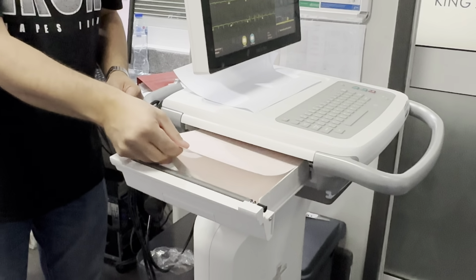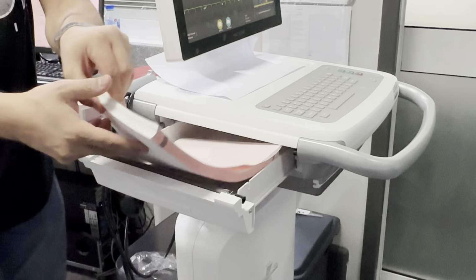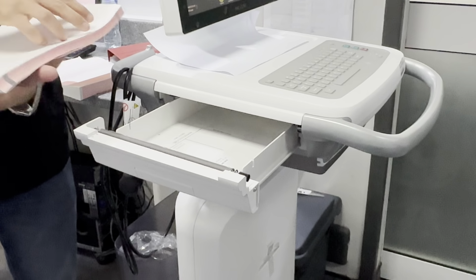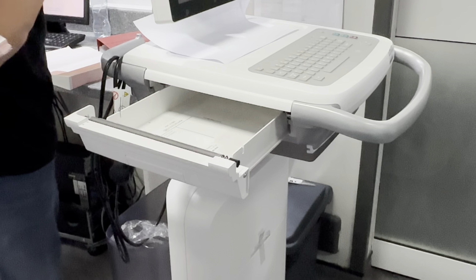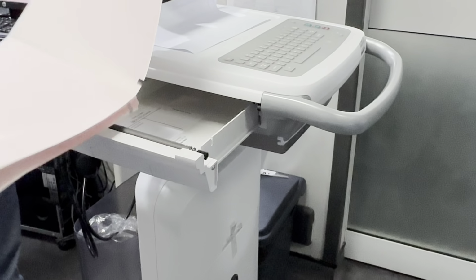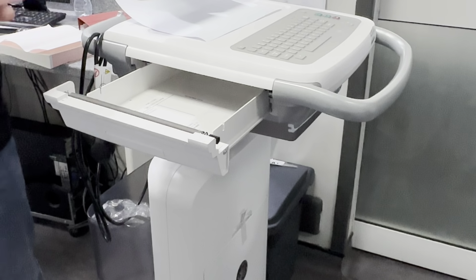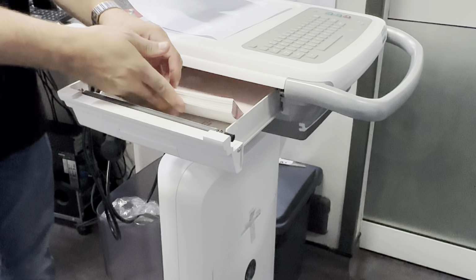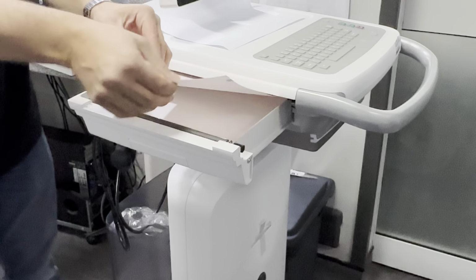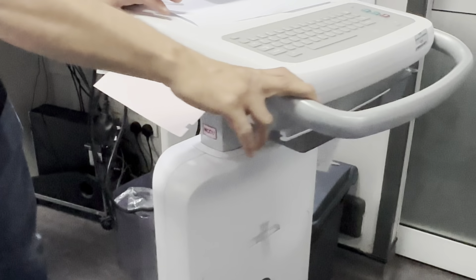Take a piece of paper out, then close your tray. Please make sure that your indicator is in the lower left part and you are printing on the right face. If I put it this way, my indicator is on the lower left part, isn't it? But if I place my papers like this, I'll start printing on the wrong face. So please make sure that your indicator is in the lower left part and you are printing on the right face.